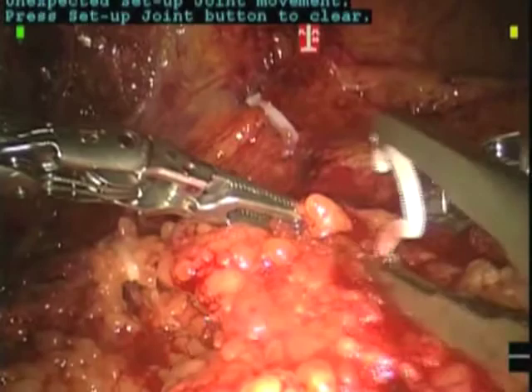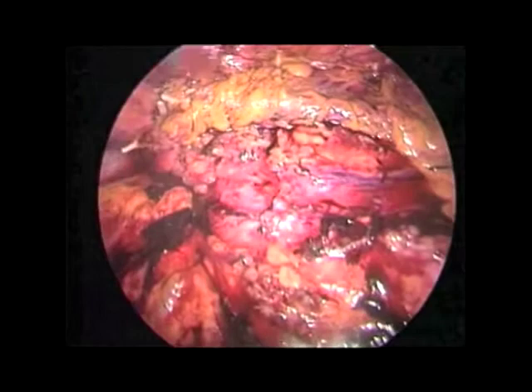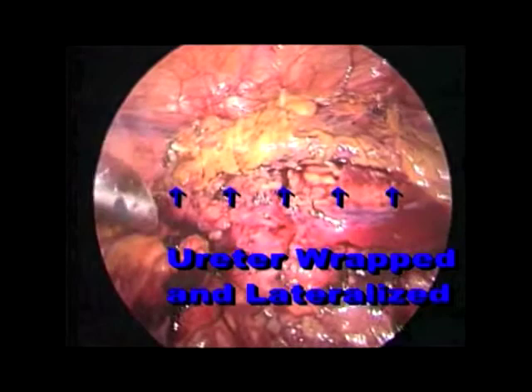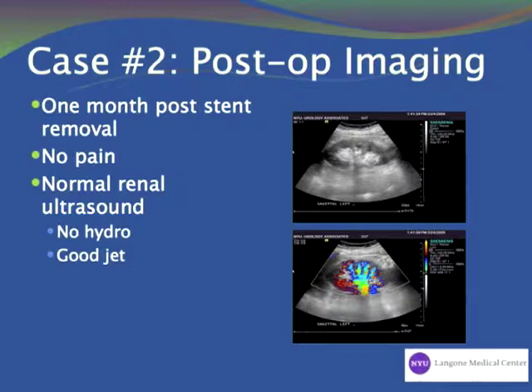Here is the laparoscopic view of the final product. This is where the retroperitoneal fibrosis is, and here is where the ureter now lies — wrapped and lateralized with omentum. Here we are one month after the stent has been removed: the patient has no pain, normal ultrasound, and good ureteral jets.